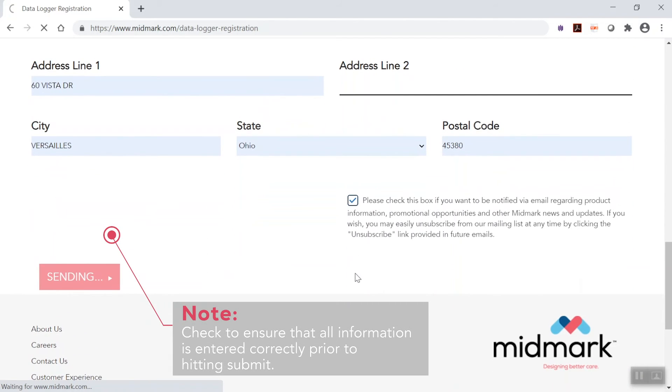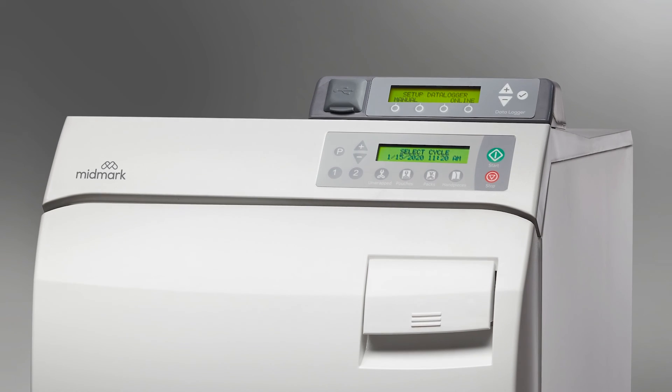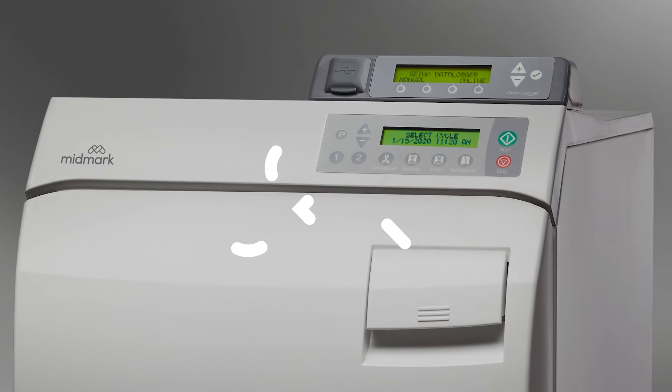Once you have the unlock code, you may choose to continue the data logger setup using either a manual or online method. This concludes the sterilizer data logger installation video.